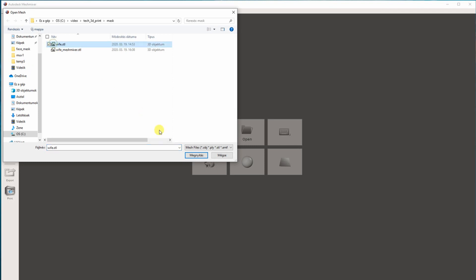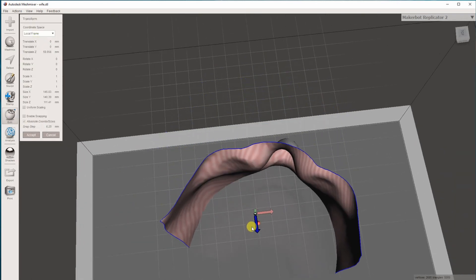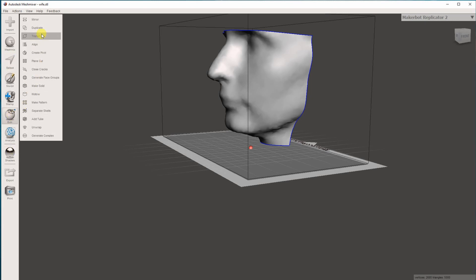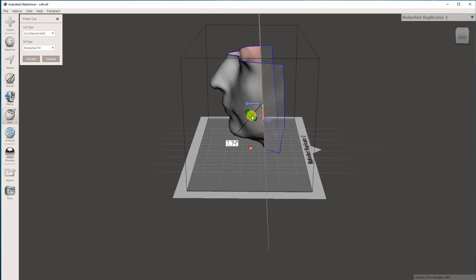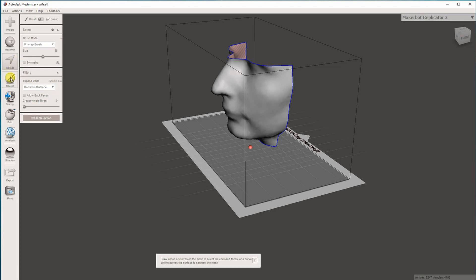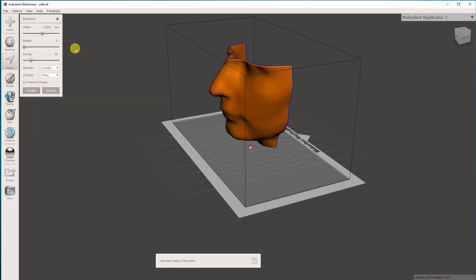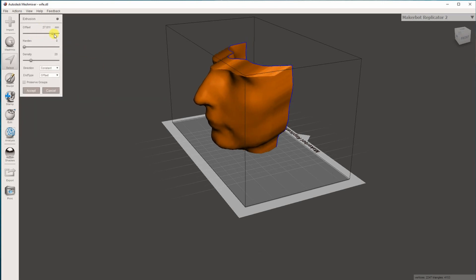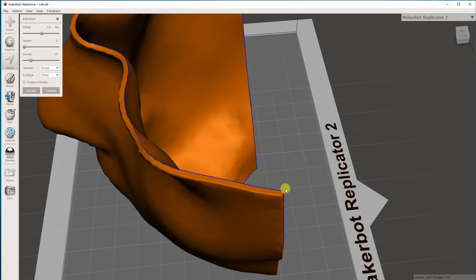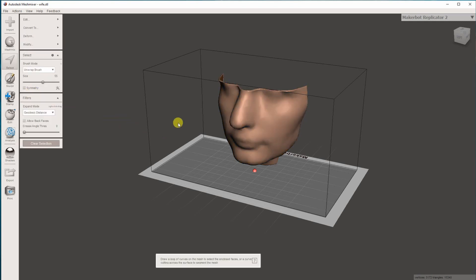Meshmixer is free software. The first step is to import the file and then transform it to move it into the working area. Optionally you can do some additional cropping here. Then a very important part: we have to extrude our surface to get a three-dimensional object. Don't forget to extrude it in the proper direction — the inside of the mask has to be the correct size — so extrude outward and enable the normal to get a constant thickness.